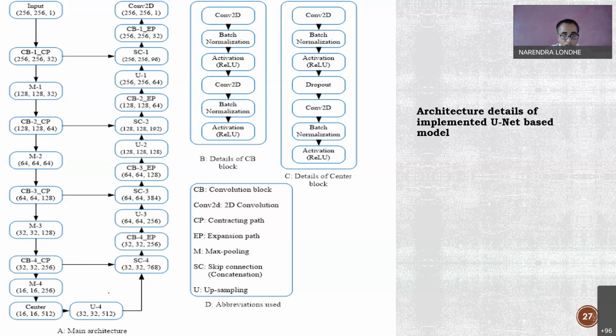This is the U4. Now here I'm starting the upsampling, and this is my skip connection. So skip connection is this one. Now here, the features extracted in this convolutional layer will come as a reference to the skip connection. Based on this information, I will take the features from my upsampled data to this convolutional layer. So these are the skip connections everywhere.